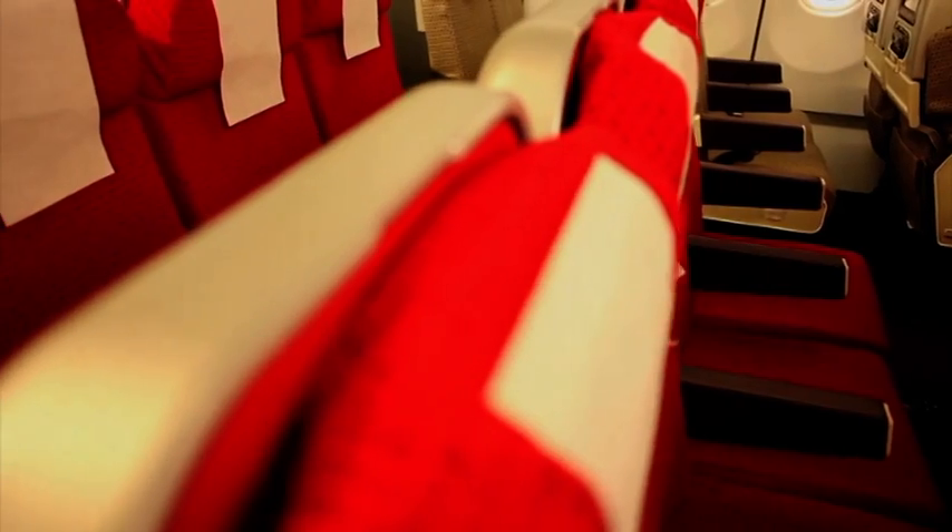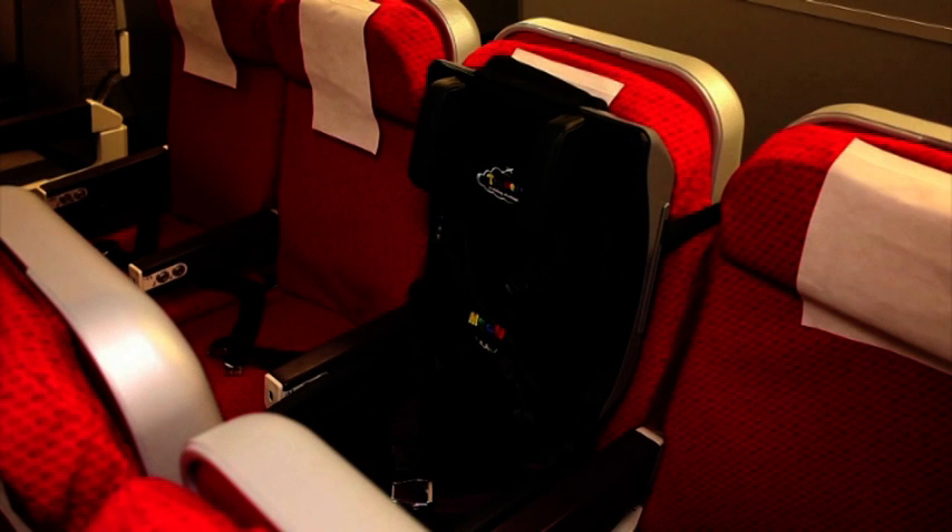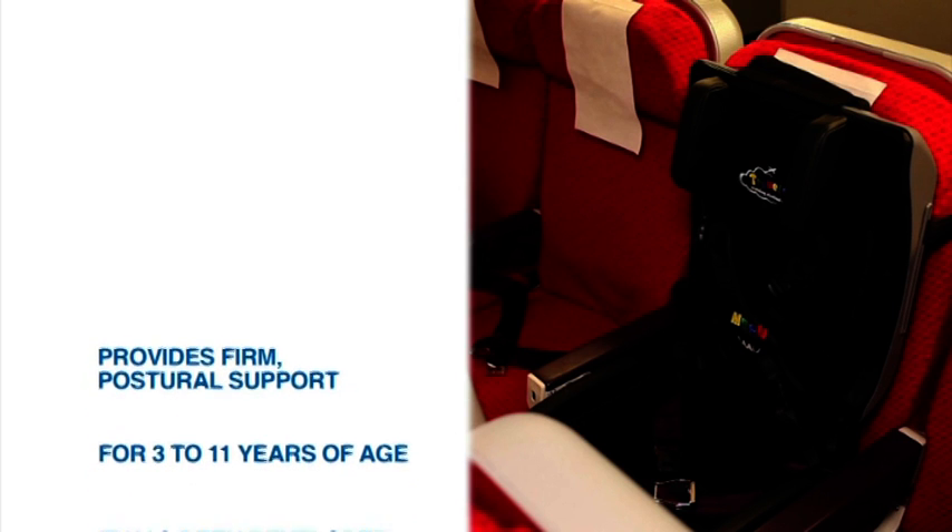Some children with moderate or severe disability have not been able to fly without additional seating support. The Meru Travel Chair can make this possible. The Travel Chair is a unique product that provides firm postural support for moderately or severely disabled children.